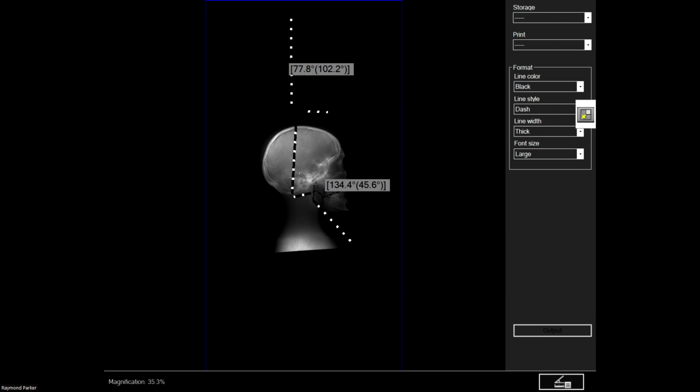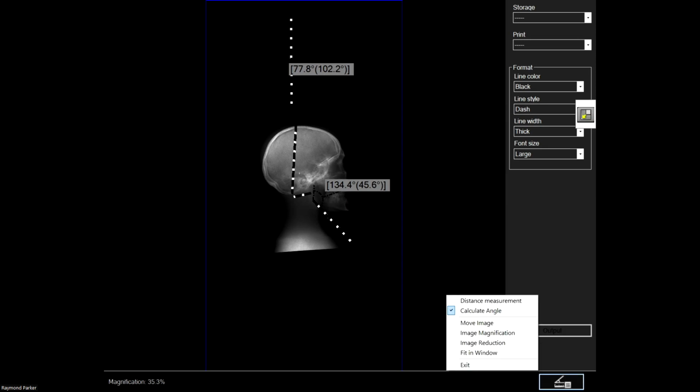Very easy to do when you do angle. Generally, I've only used angles once or twice, and that was in an intraoperative environment where they were straightening a scoliosis patient's spine. They used the angle and then they were using distance from there forward. That measurement or angle could be sent to PACS the same way the measurement was.